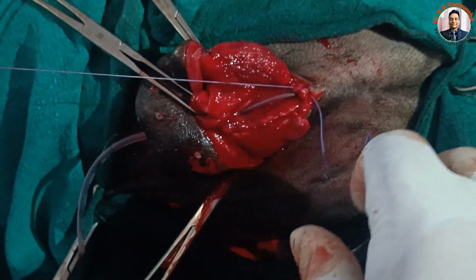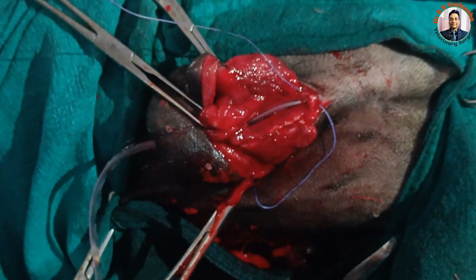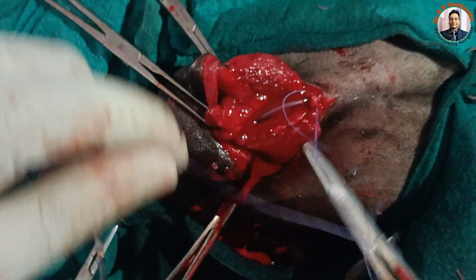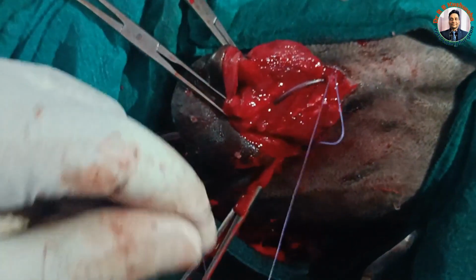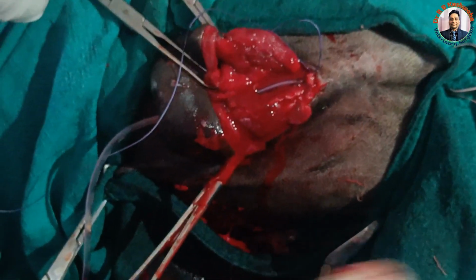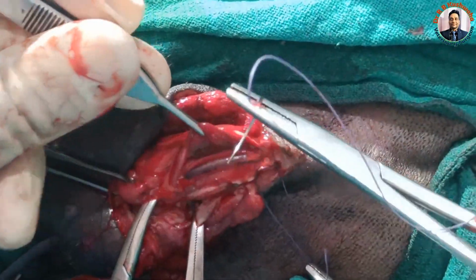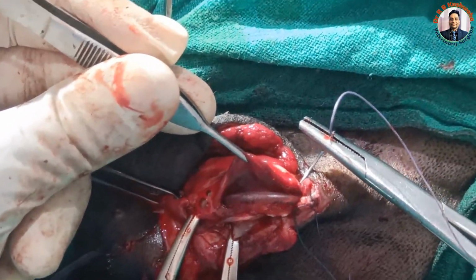Take the needle holder and the gauze piece. Needle holder, not that one. So now we unite the mucosa here. So now we take the bite here from the urethra.